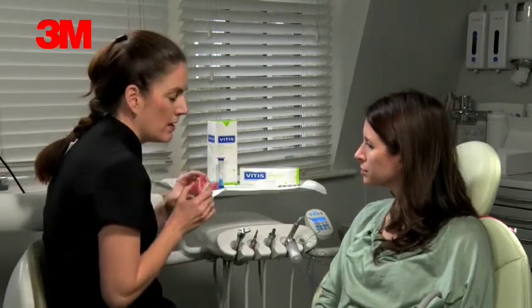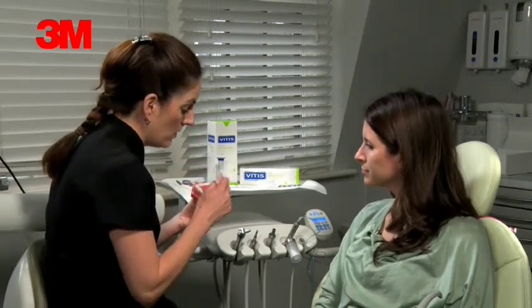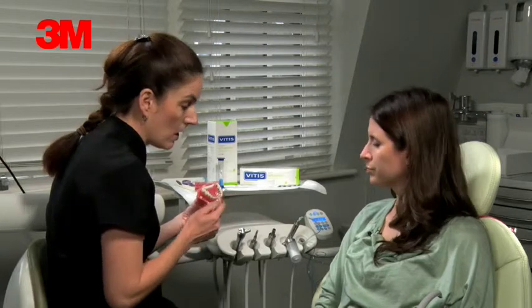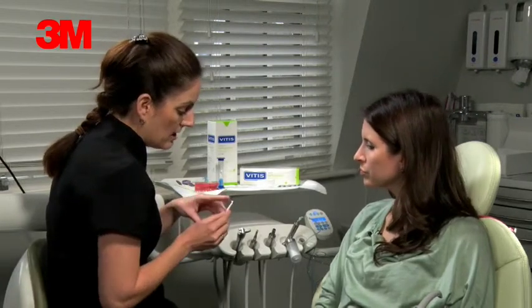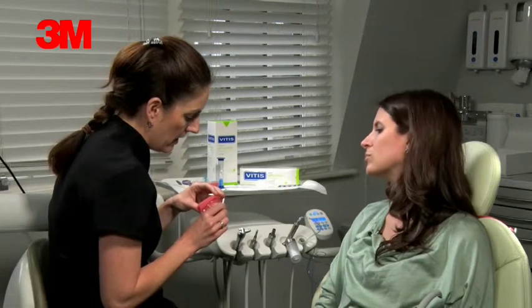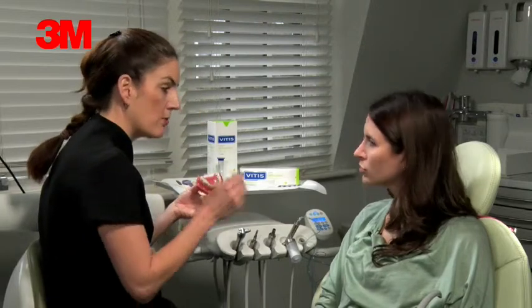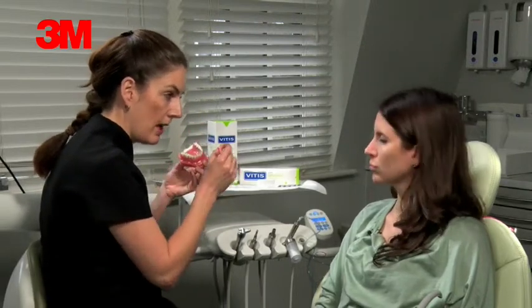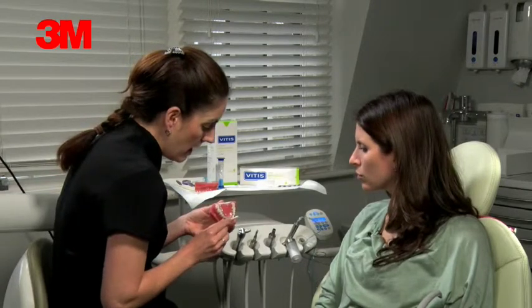What do you use in between the teeth at the moment? Do you use floss? Floss is okay going down at the back, but it won't go down at the front. So what you can do is use a little interdental toothbrush — it just goes in between at the front. Or you can use super floss where you just thread it through, do that section and pull it out. You also need to use it underneath the wire here as well, going around each section — it's going to take you a little longer to clean.